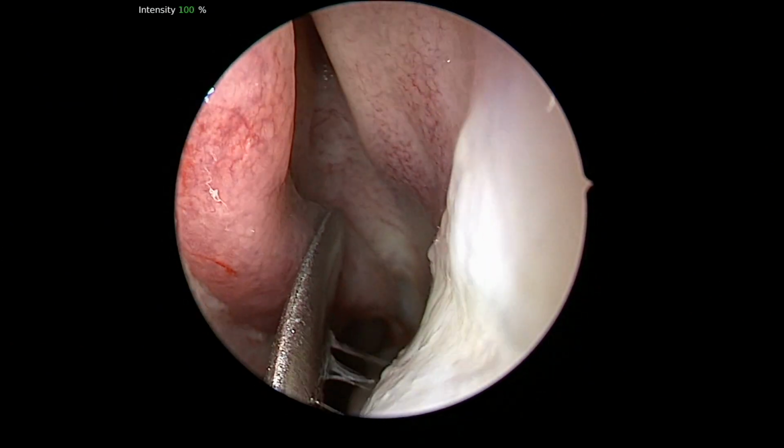Note the relationship of the target area for cryotherapy relative to other structures of the middle meatus. We are well below the uncinate process and the bulla ethmoidalis. The balloon is going to sit inferior to all of those structures, which is not an area we are typically used to working in with traditional sinus surgery. It does take a little bit of an adjustment to get used to placing the balloon more inferiorly and posteriorly in the middle meatus than we normally might if we were to do endoscopic sinus surgery.